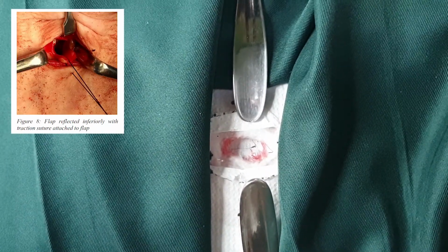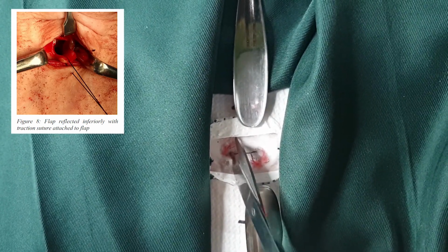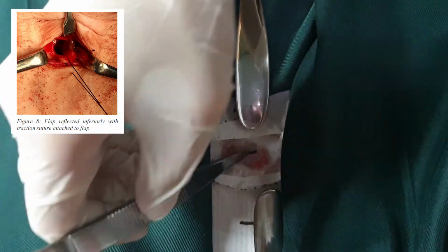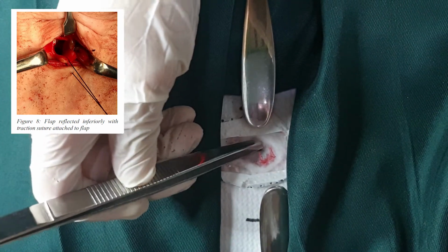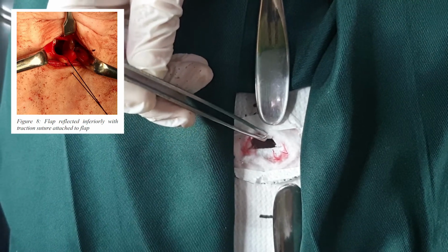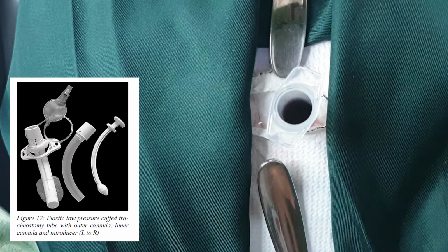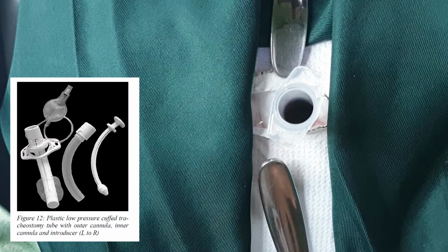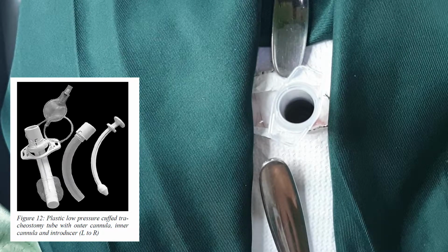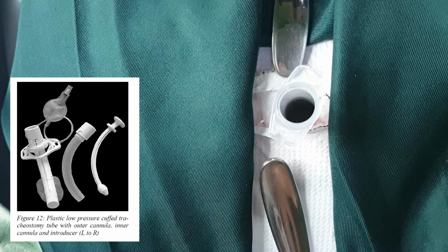To create a tracheostoma, create an inferiorly based flap raised from the anterior wall of the third and fourth tracheal rings. A silk traction suture is passed through this anterior tracheal flap and loosely secured to the skin. For the insertion of the tracheostomy tube, assess the size of the trachea and select the largest cuffed tracheostomy tube that comfortably fits the tracheal lumen. Inject air into the inflatable cuff of the tracheostomy tube to test the integrity of the cuff.